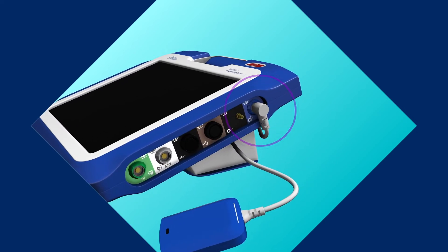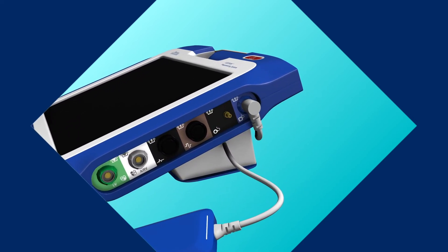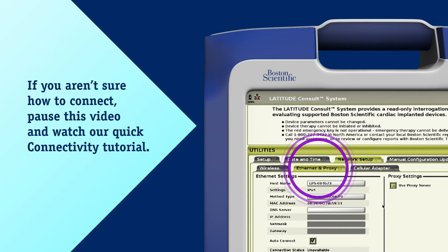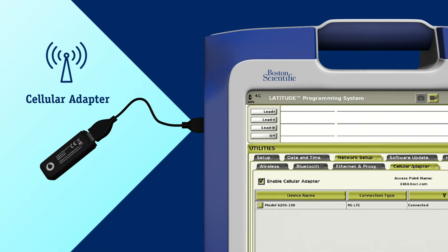Before using the Latitude Consult system, ensure the telemetry wand is connected to the blue port on the upper right side of the programmer, and make sure the programmer is connected to a network by cellular adapter, ethernet, or wifi. If you're using a cellular adapter, attach it before you power on the system.